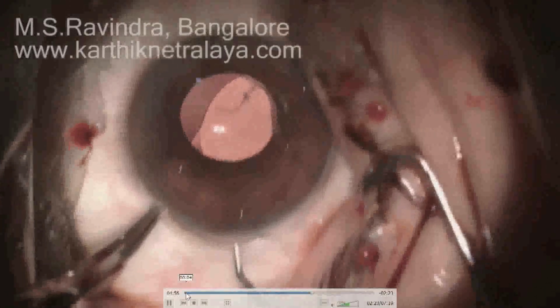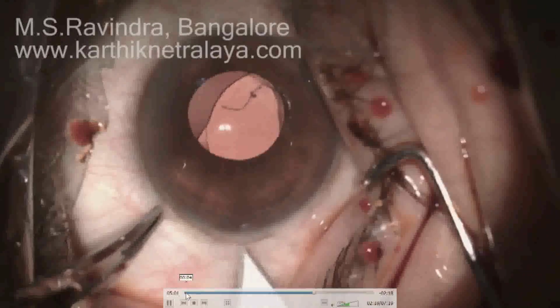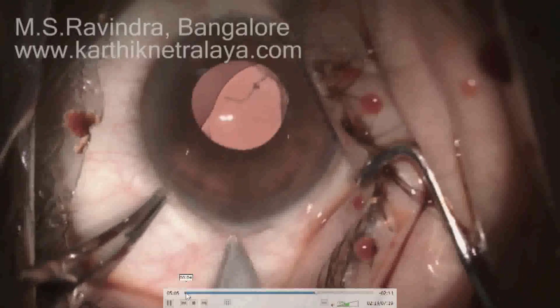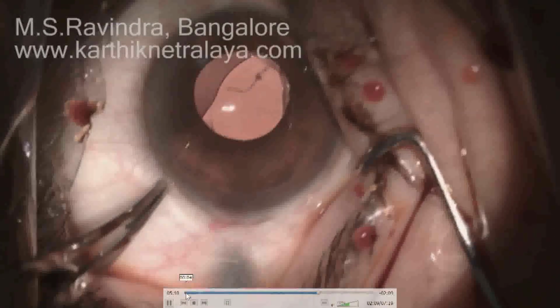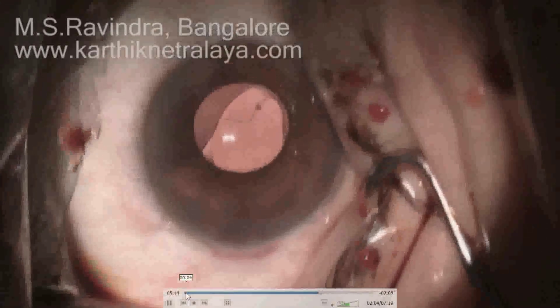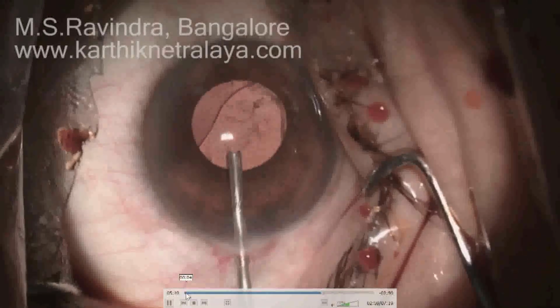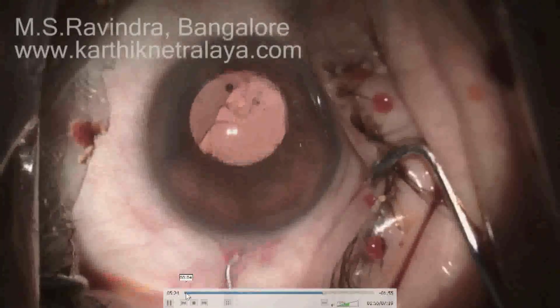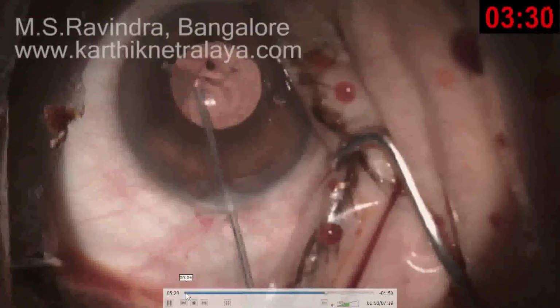And there's another case where, a couple of weeks after surgery, you notice the lens is not stable in the eye. The patient already had undergone vitrectomy during the primary procedure, and the lens is not well supported by the capsule in the sulcus area. It's decentered, so it's a sclerocorneal tunnel, a short scleral tunnel. It's very difficult to open the sclera even a few weeks after the surgery. Lignocaine 1% is injected into the anterior chamber to anesthetize, as this is done under topical otherwise.